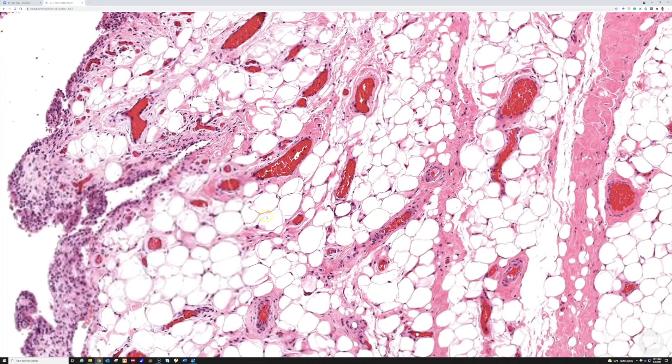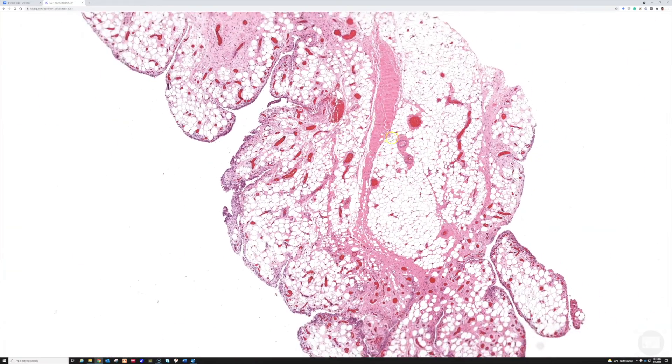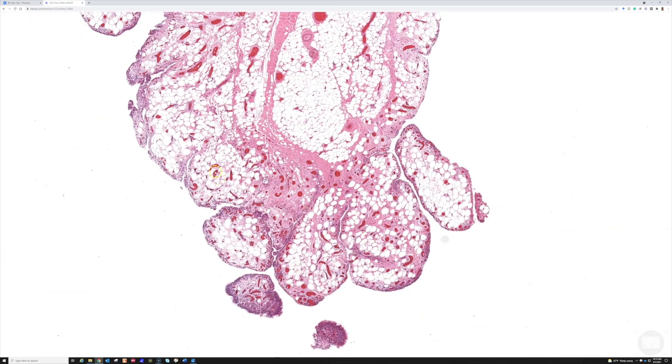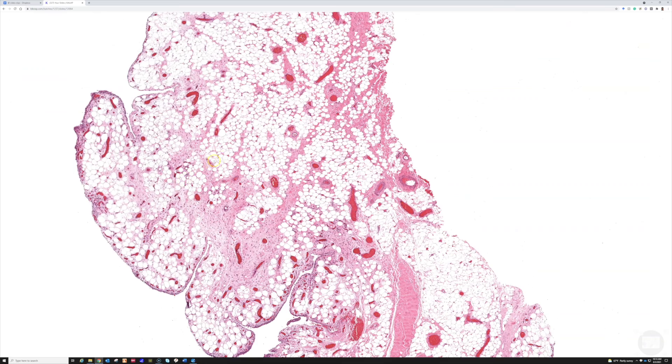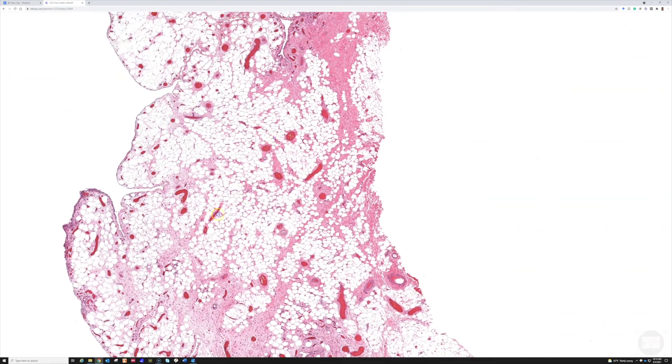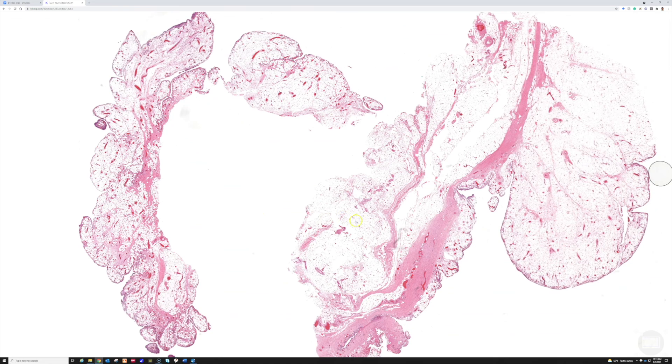I forgot to mention that you often see a lot of dilated vessels in the adipose tissue, as you can appreciate here in lipoma arborescens, and you can also see some mixed inflammatory cells as well. Make sure to go check this slide out so you can explore it for yourself.